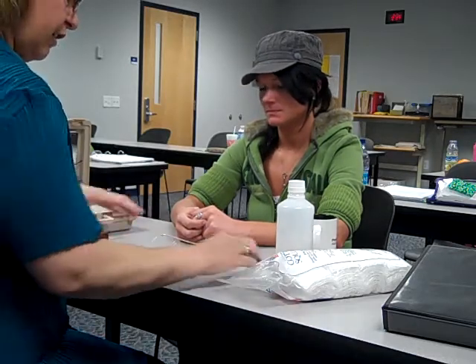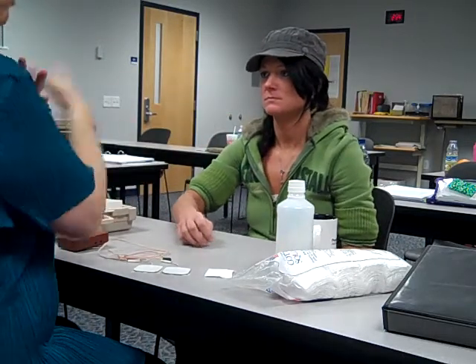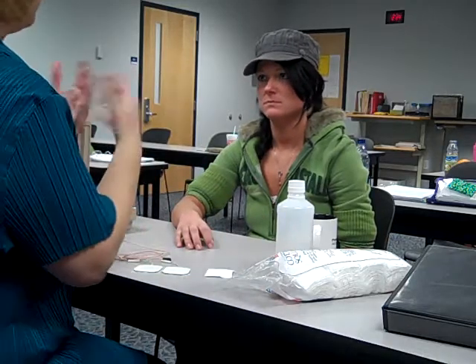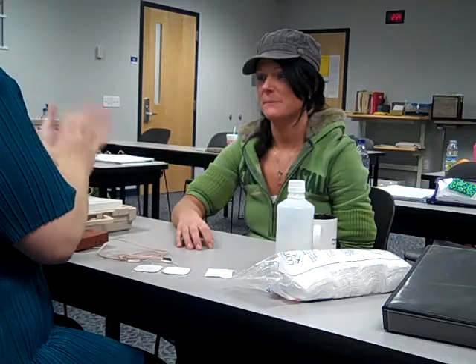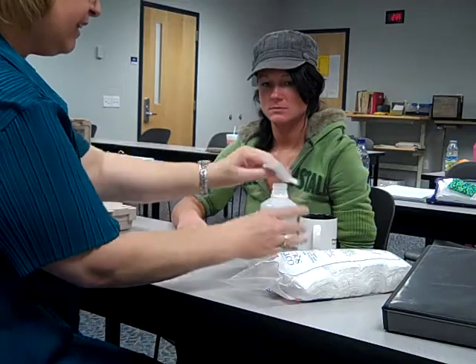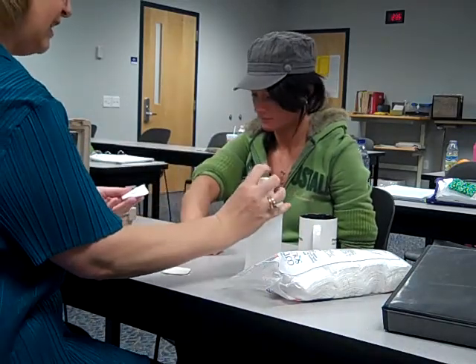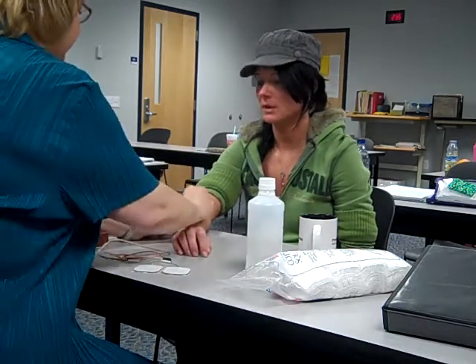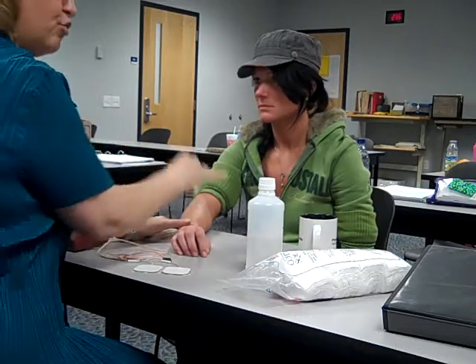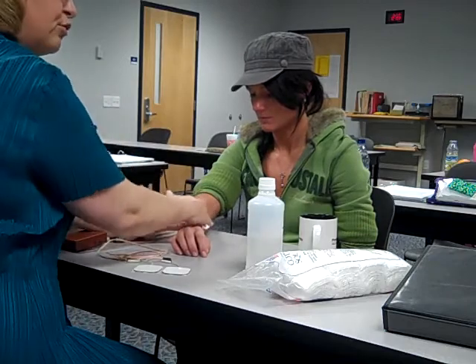I think we are ready to get started. First thing we're going to do is check the 19 contraindications — we're not going through them right now, but for the check off you'll need to know those. We've checked the chart, all 19, and we're not a problem for you, so we're going to go ahead with the treatment. We need to clean the area to make sure we have dead skin cells off and any lotion removed, so we're going to rough it up a bit. Make sure you cover the whole area where the electrodes might go.